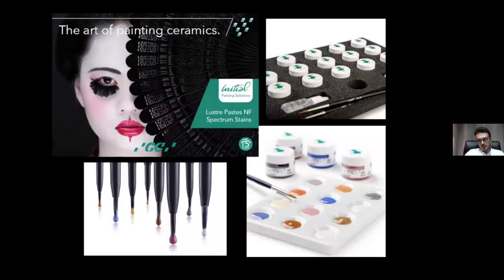Another system that I use more now is the GC Initial IQ, new formula. They are all the same material or the same components, but of course they are from different companies. So maybe one kit would have more color varieties than the other, but in the end you can mix colors to produce whatever colors you want.